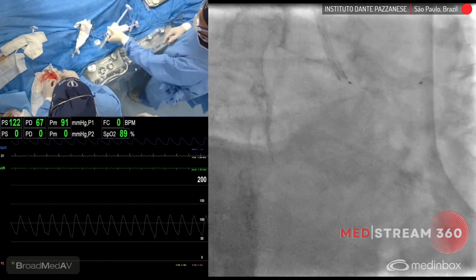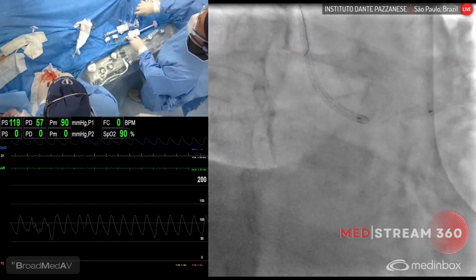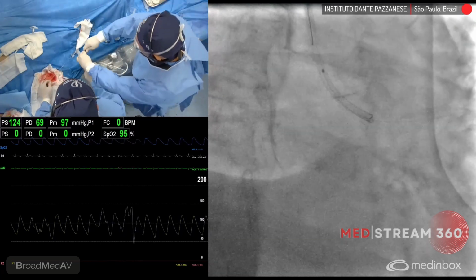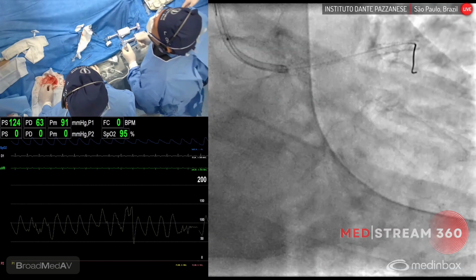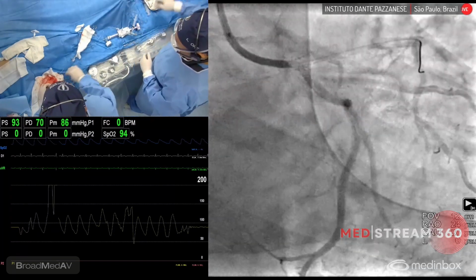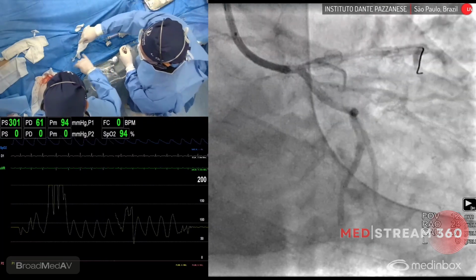So 14, deploy with 10. There's a 4.0 by IVUS. Now you went to 14, and I think you're just in the perfect position there. Let's see by angio. Yeah, 1, 2. Control angio. Oh, good, beautiful, beautiful. I think excellent positioning. Patient is very stable. Pressure is okay.